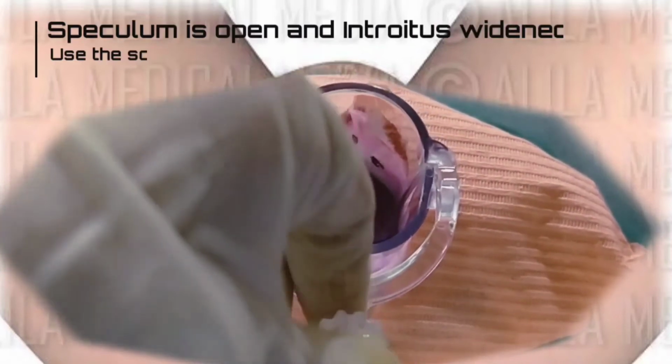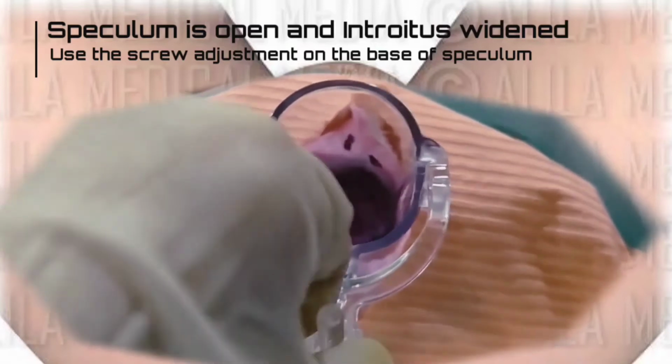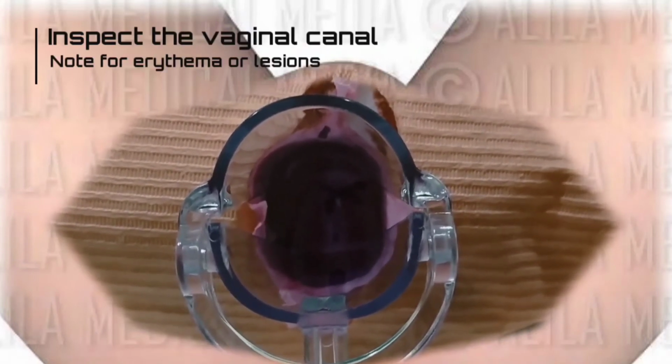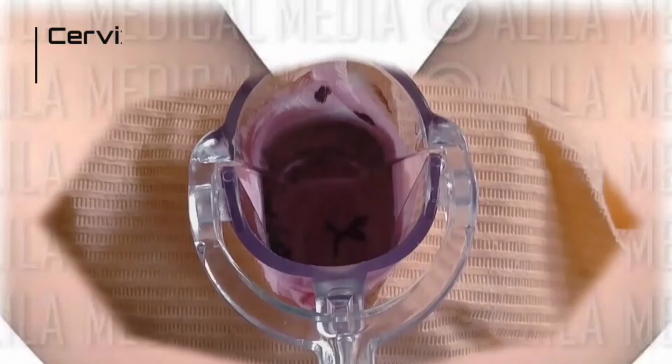Once the cervix is visualized, the speculum is opened and the introitus widened. This can be done by using the screw adjustment on the base of the speculum. Inspect the vaginal canal. The vaginal epithelium is noted for evidence of erythema or lesions. Cervix is inspected for erosions, shape, the transformation zone, and lesion.